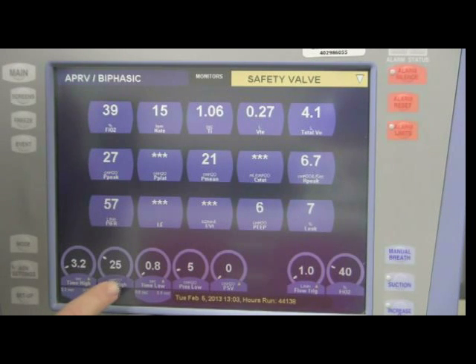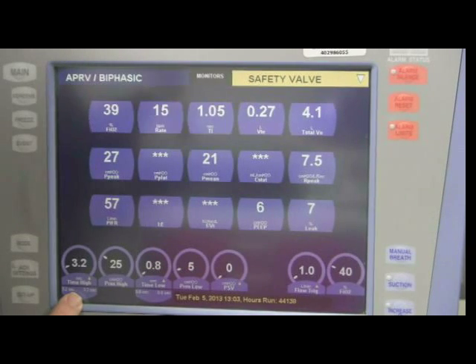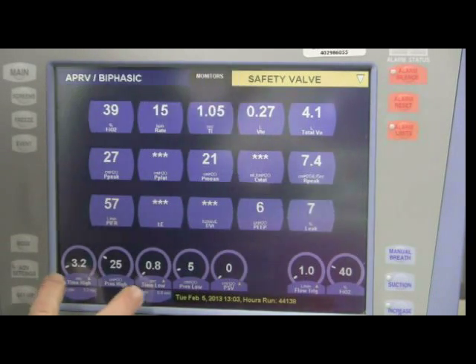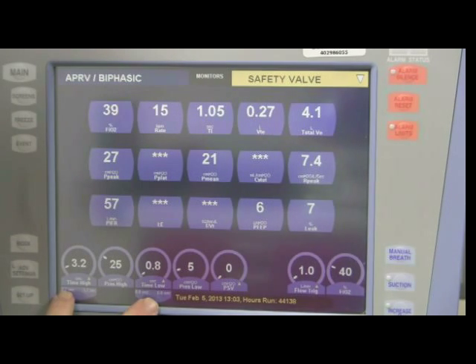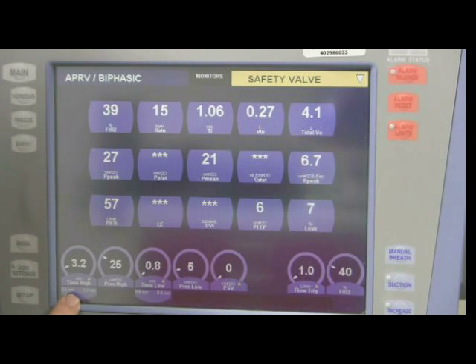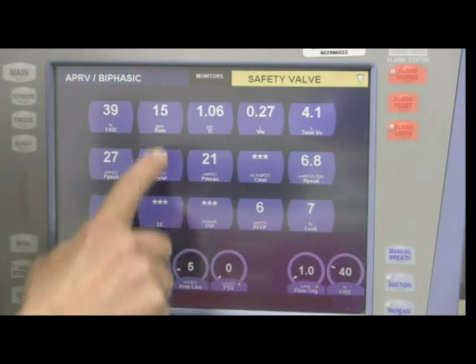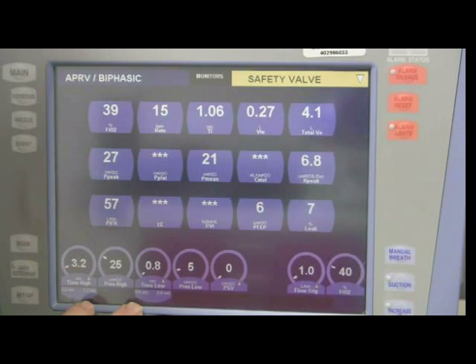How much time we're spending at pressure high is defined here — 3.2 seconds, for example, is the time high. In a minute I'm going to show you how to look at these and determine both your IE ratio and your rate. So we're spending 3.2 seconds at time high and 0.8 seconds at time low, and as you can see that gives us a rate of 15.